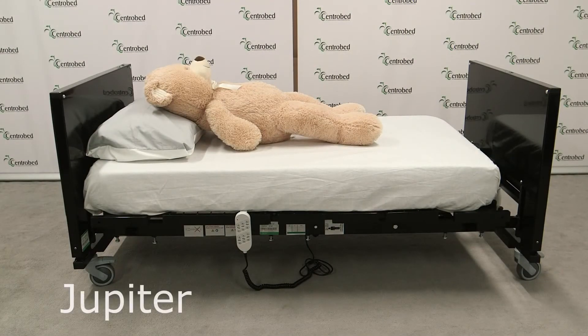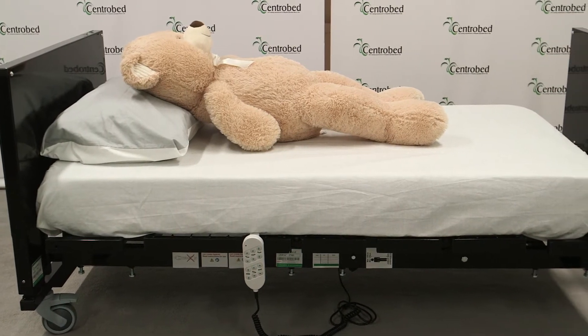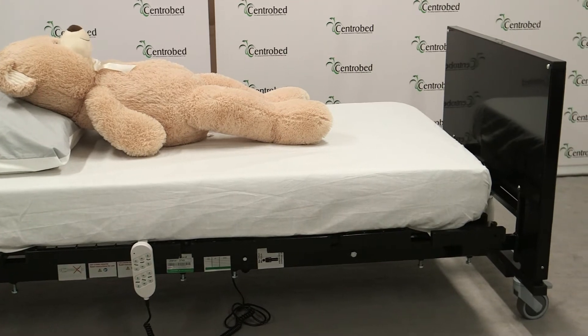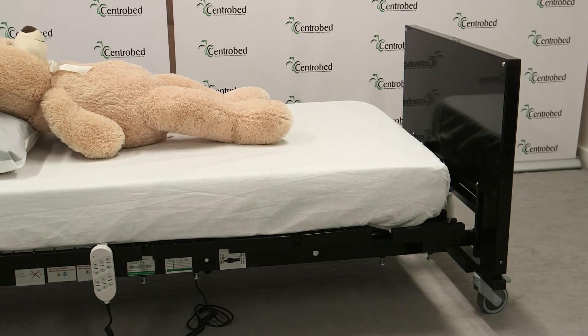The next bed is the Jupiter bed. What we use it for is to make bespoke a four-section profiling bed, so we can make it as long as we like. The biggest one I've done is 10 foot long, and we've done them over 66 to 72 inches wide, so they're quite big versions.